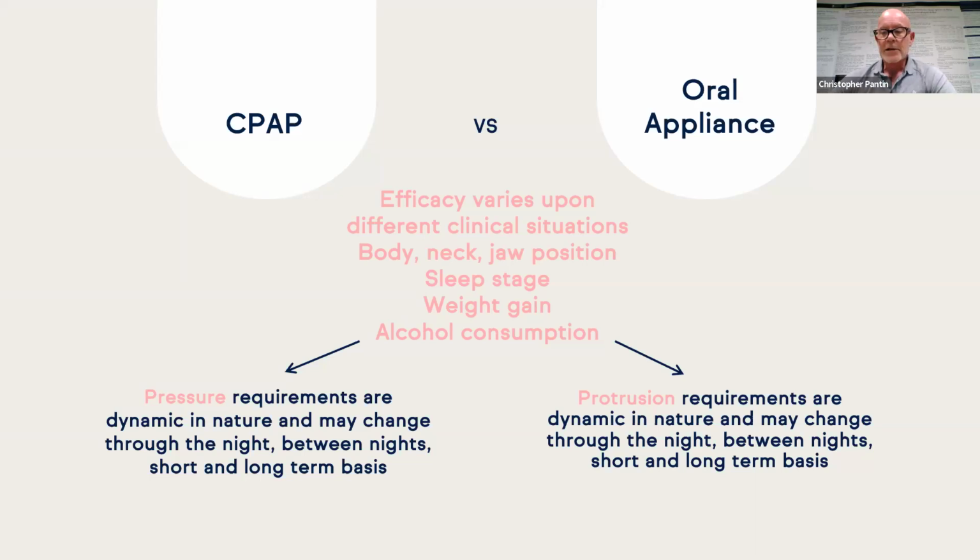The only difference is that we can achieve that with CPAP more easily, especially with things like APAP, where the pressure varies on demand, whereas with the splint, we don't have that luxury. So splints are more like CPAP in that CPAP is a continuous pressure throughout the whole night, except for ramping, of course, if you want to get technical. But basically, it's a constant pressure. And then the splint, it's very difficult to adjust a splint in your sleep. So they tend to be a fixed position for the whole night as well.